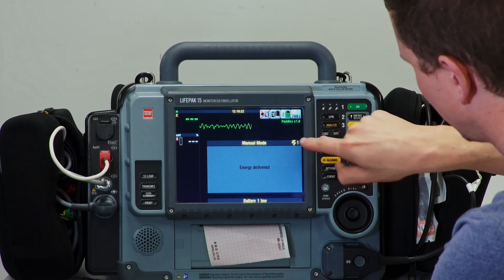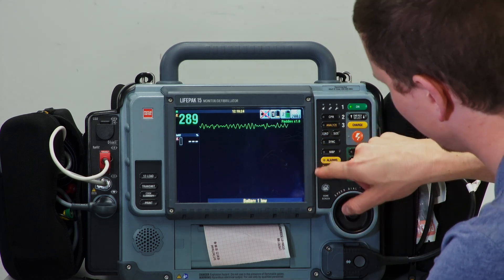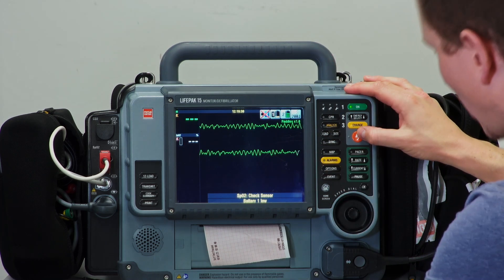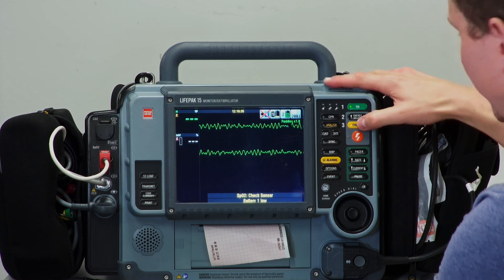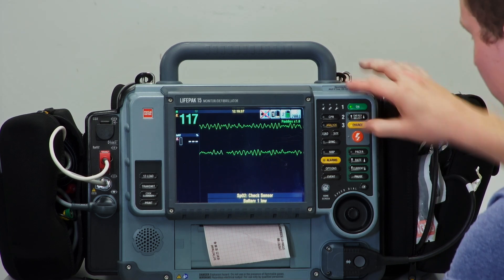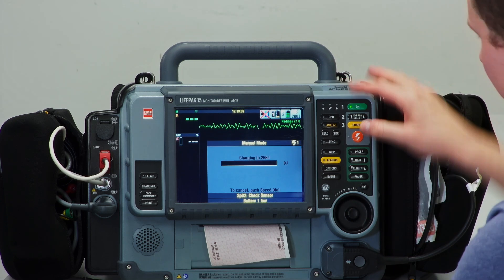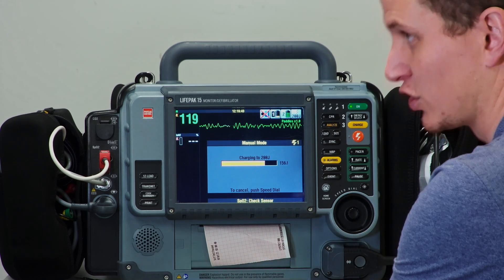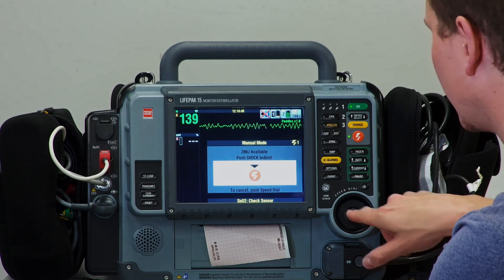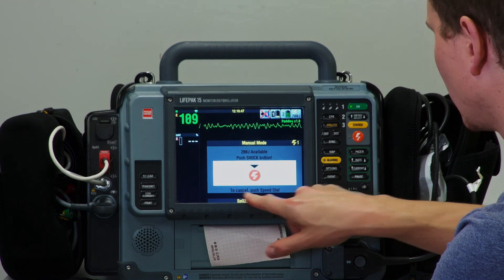It tells you here how many shocks have been given, which is really useful. Let's say you charge by accident but actually want to disarm. The machine will eventually disarm by itself if you leave it for long enough, or you can just hit the dial button. If I hit charge and I'm no longer needing to deliver the shock, you just hit the dial button. It says to cancel, push speed dial—you just hit the dial and it disarms, so no defibrillation was given.